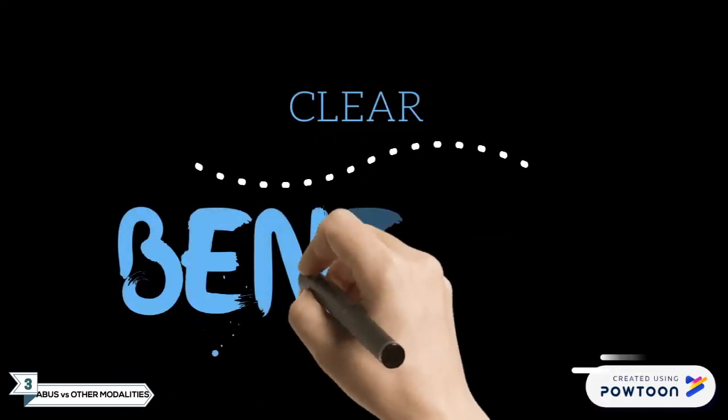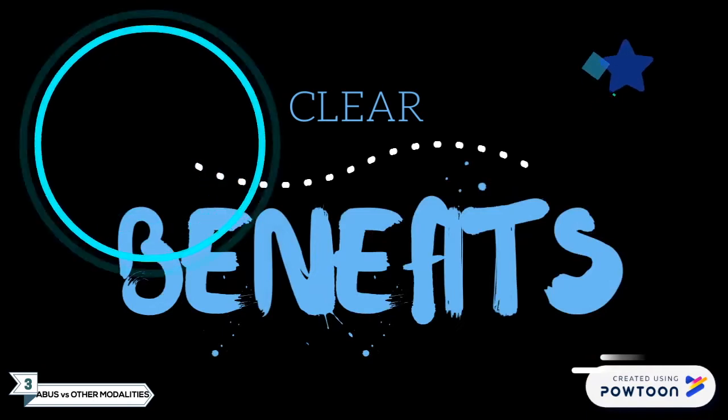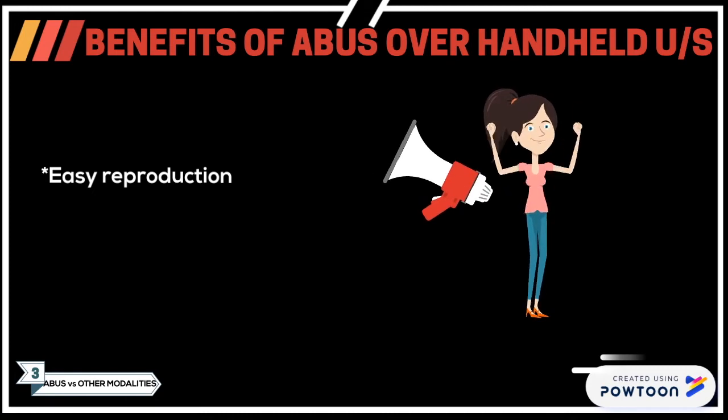There are some clear benefits of ABUS found. However, these benefits are not so much related to the accuracy of imaging, rather they're toward patient care. ABUS is more easily reproduced. Also, scans are done at the same level whether it's by a trained sonographer or a mammography tech. This is from a study.